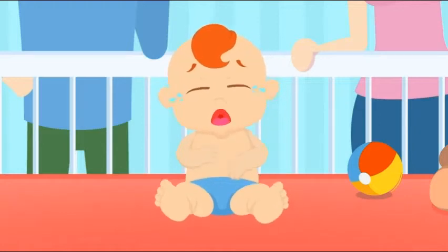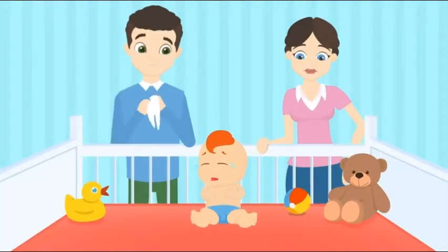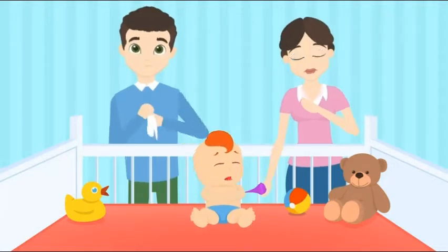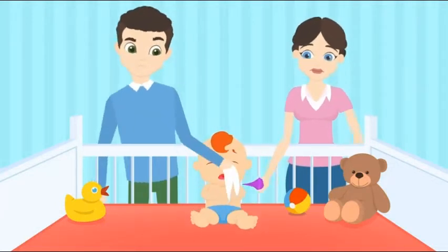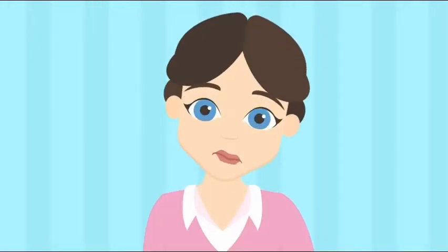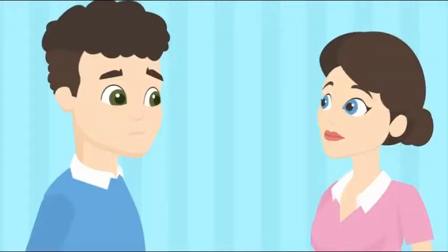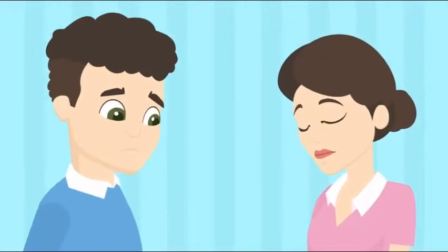When your little one is suffering with congestion, all you want to do is help. But your fussy baby wants nothing to do with your efforts, and trying to clear out that tiny stuffy nose can seem impossible. At OCO Baby, we're parents too, and we understand how frustrating it is when your little one is hurting.